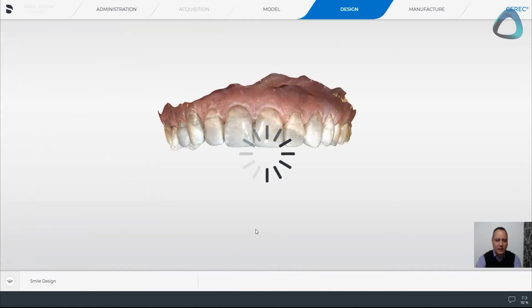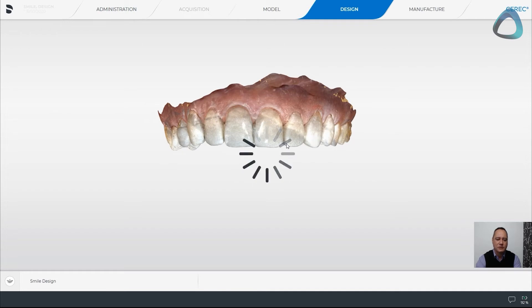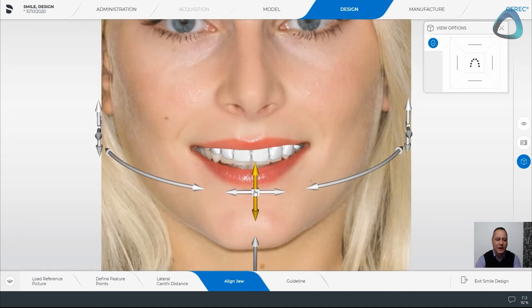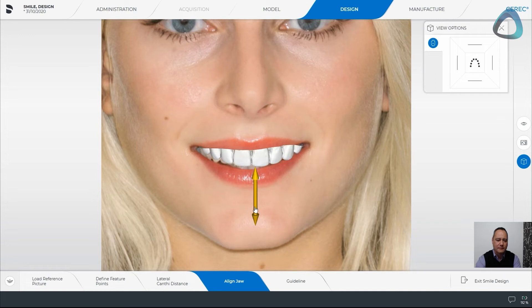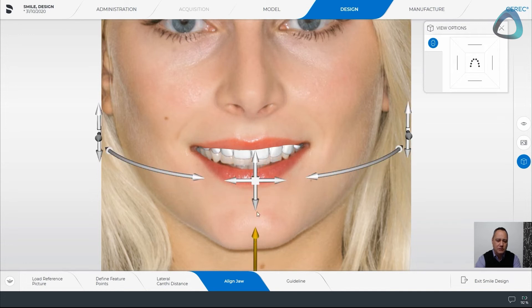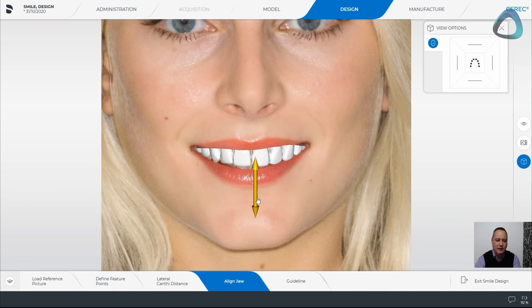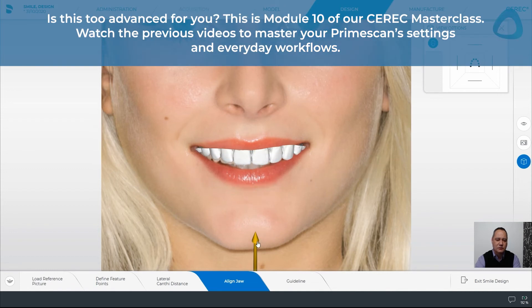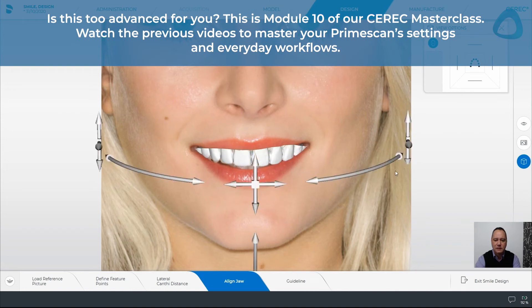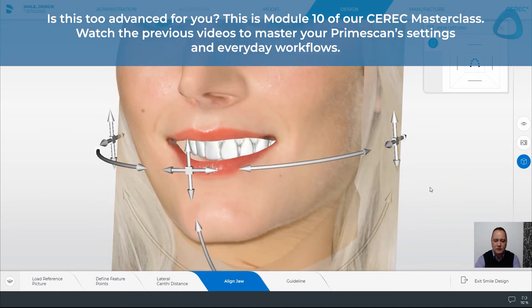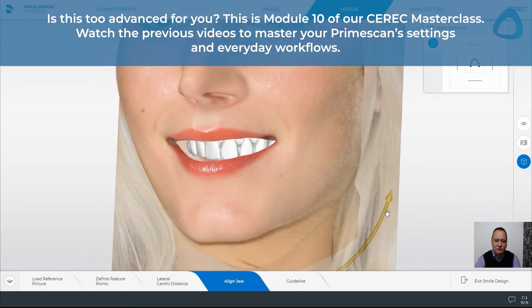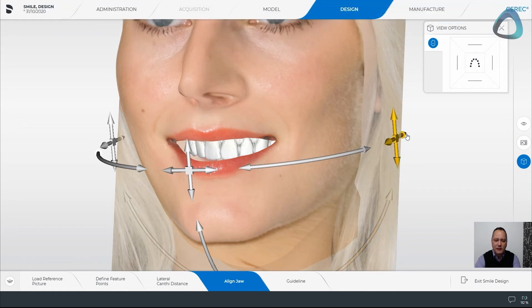We leave that and go into the alignment phase. Here you can see our mock-up from the original — we had a copy of the patient's original teeth prior to creating extra anatomy and changing the form a little — and we now have our teeth to overlay. We can move it up, change the pitch, bring it down, and overlay the teeth as best we can to find where it sits comfortably over the markers. I can tilt slightly and move it back a little in the mouth. I'm quite happy with that.